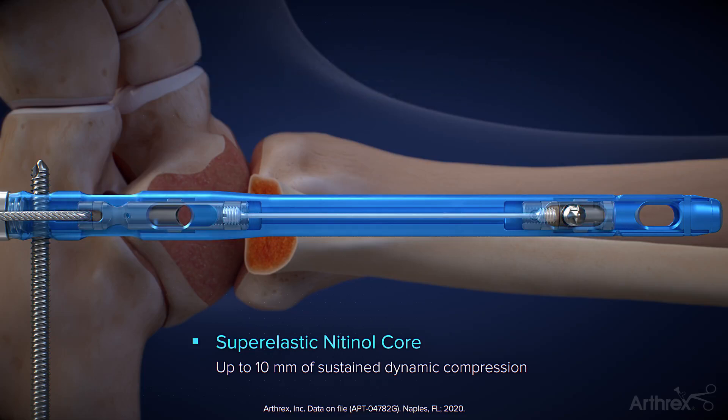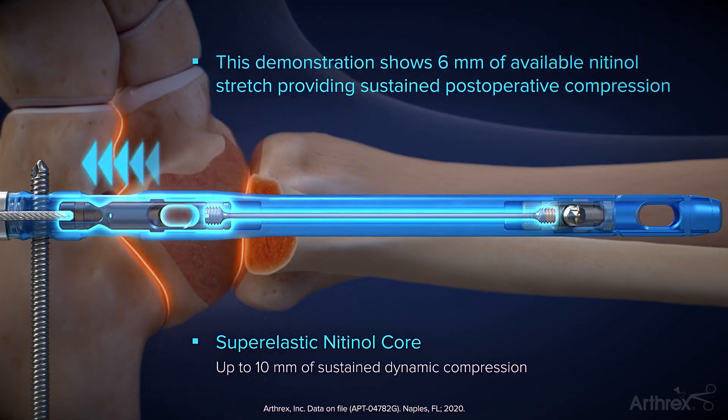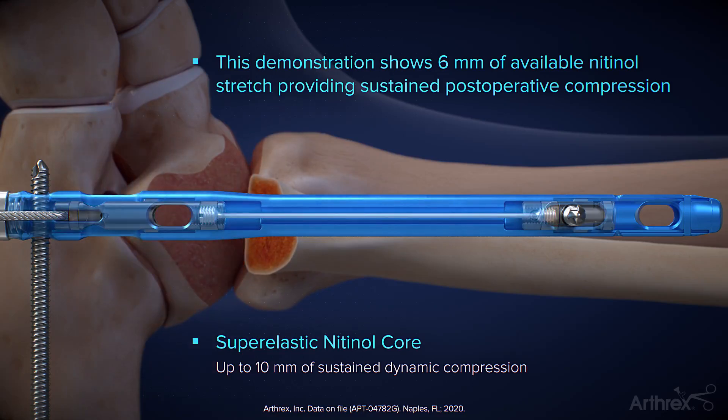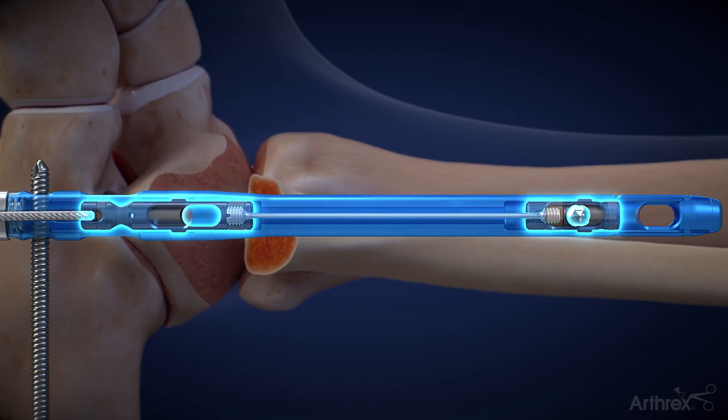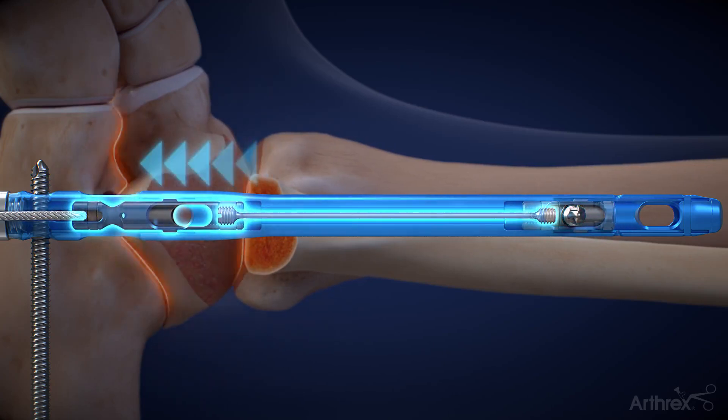When the joints can no longer compress, the nitinol element begins to stretch and continues to stretch until the distal slider reaches its final position in the distal slot. Here is that compression sequence again in slow motion.